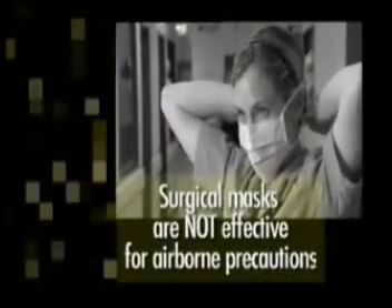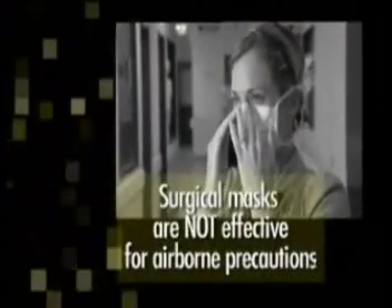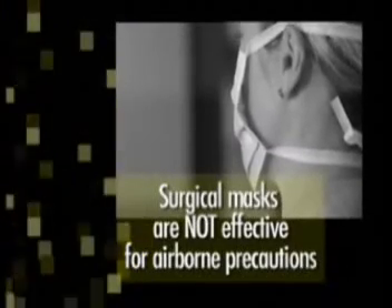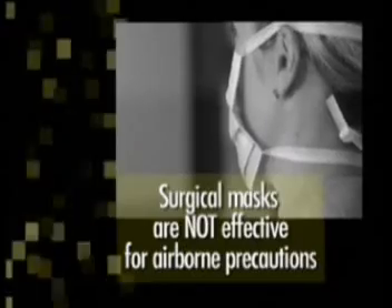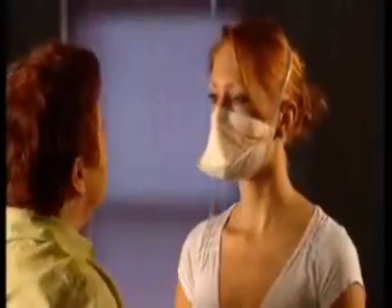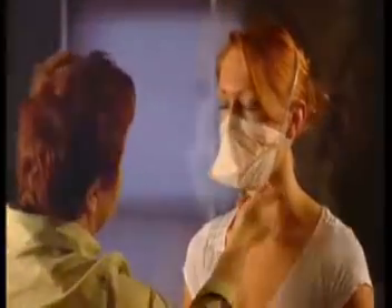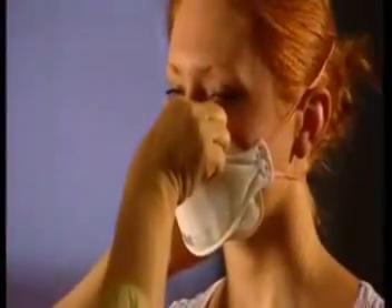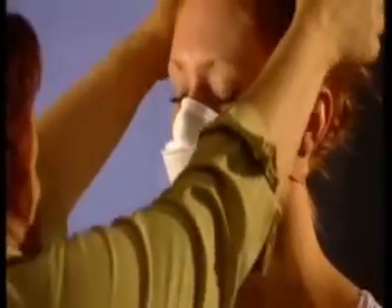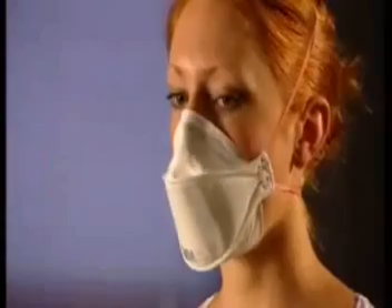Surgical or filter masks have not been designed to provide a close seal on the face or high-level particle filtration. Therefore, these masks will not provide effective protection of your airways from infectious airborne particles. Although there are many brands, models, and sizes available, there is no one mask that will fit all faces. To ensure effective protection, your mask must be selected for your face and a fit test performed.